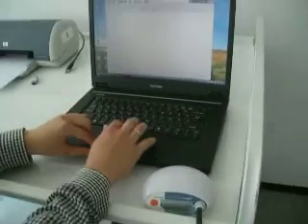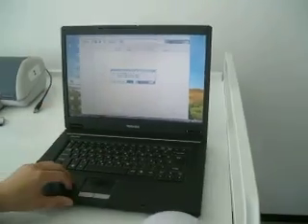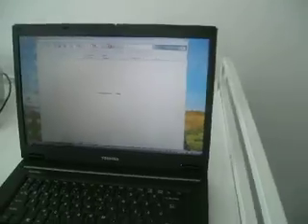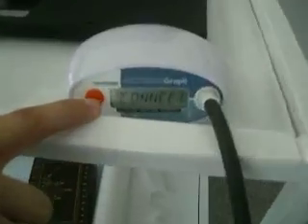To start the measurement, you don't have to do anything else than to press the start button, and after that you will get a confirmation window just as a reminder of what the suggested cuff type was. Just press yes. Now you can see that the device and the computer are communicating, and this is how the measurement starts.